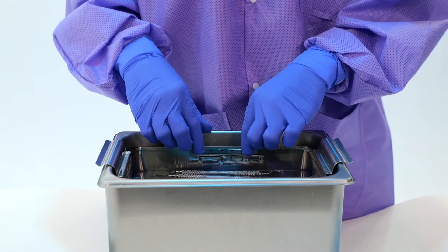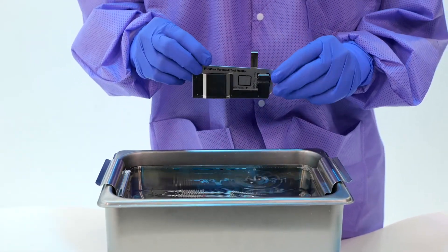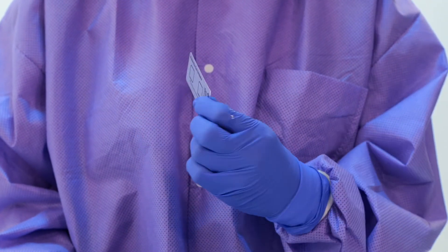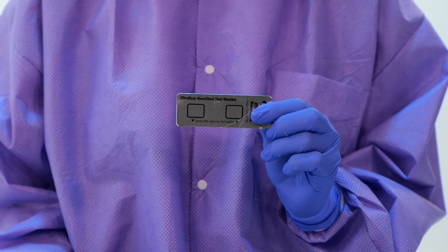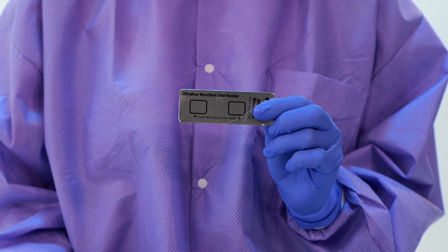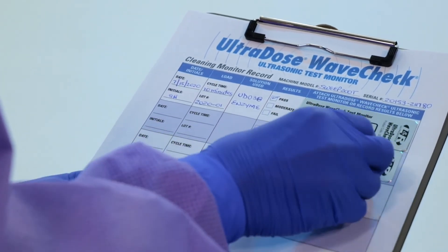Upon completion, remove the WaveCheck monitor strip from the holder and examine to check for the presence of maroon soil on both spots. Both maroon soil spots should be completely removed to confirm ultrasonic machine performance. For further information, refer to the troubleshooting guide.